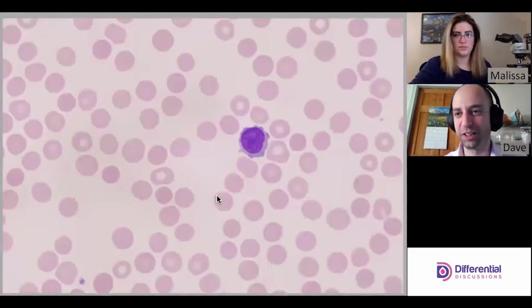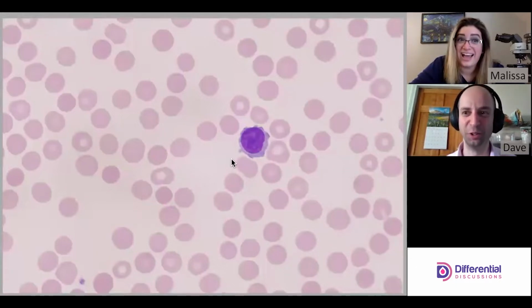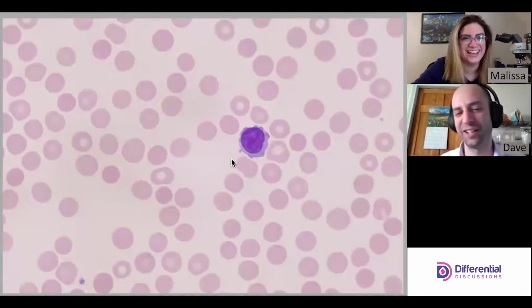Talking about normal cells, to me it's like such a shock. You're talking about leukemias, yeah, and then you're like, yeah, it's a lymph, right?